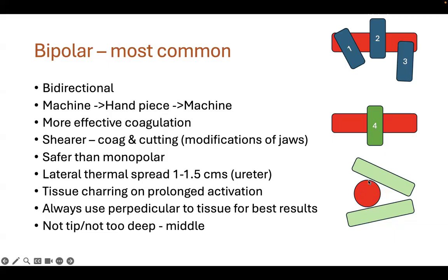So you may feel the uterine artery is completely coagulated, seeing charring on the surfaces, and when you cut it, the vessel starts bleeding. So in these cases, what you have to do is that even though you have seen charring, pour some water on it.